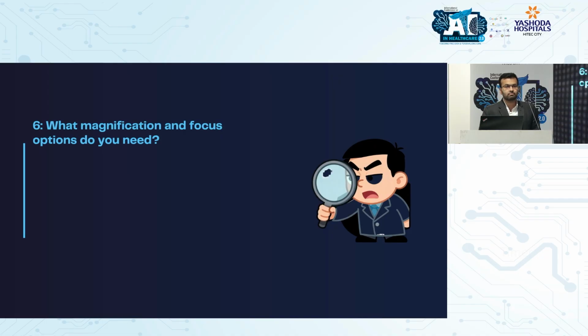What magnification and focus do you need, right? So 40x is what we all need. Some cases we need 100x. If you want to scan bone marrows, then you might want 100x. So there are scanners which are capable of doing oil immersion scanning also.